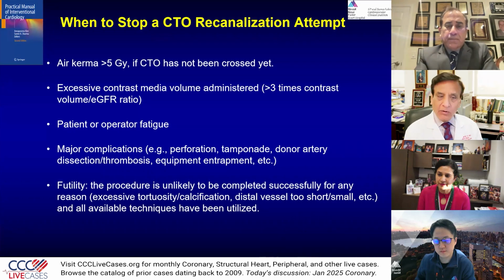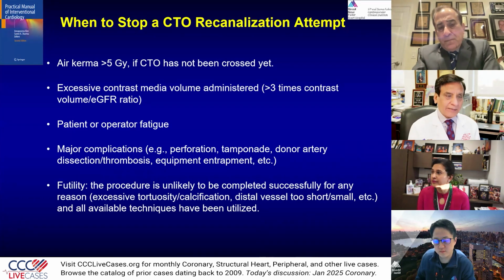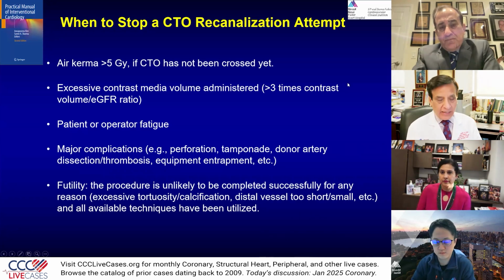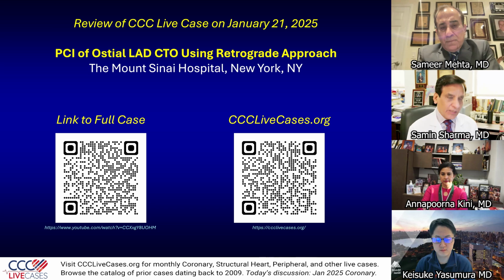No perforation, no extravasation, the least traumatic retrograde CTO I have seen in a long time. I've never seen this kind of phenomenal case with the least trauma to any existing vessels or any side branch. The only question, as I said, is could we have used IVUS to help us get into that?